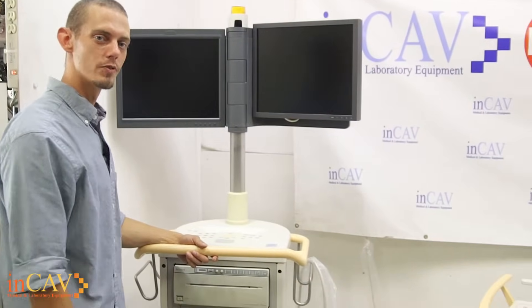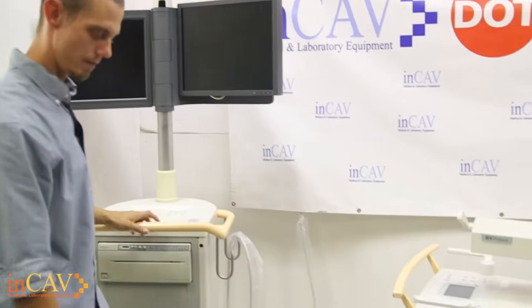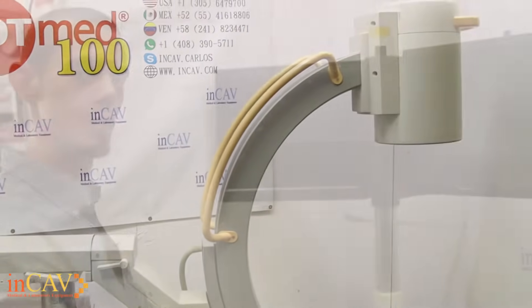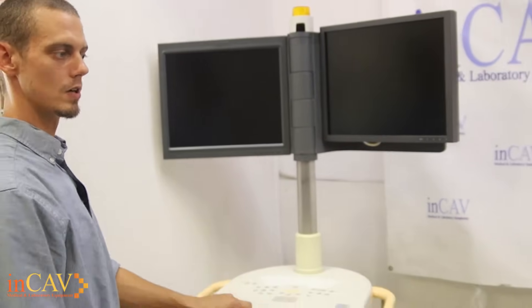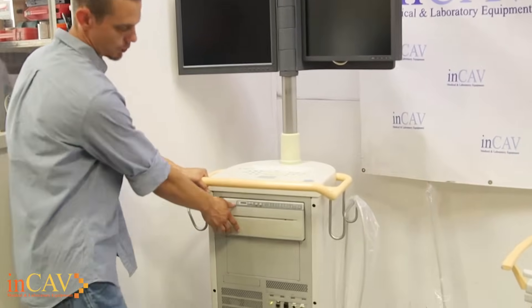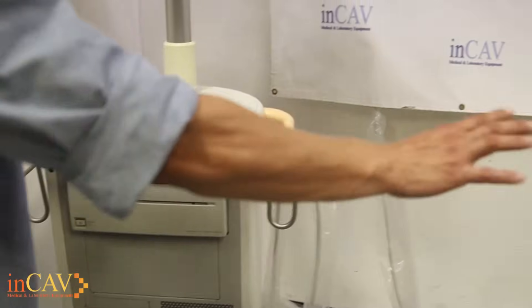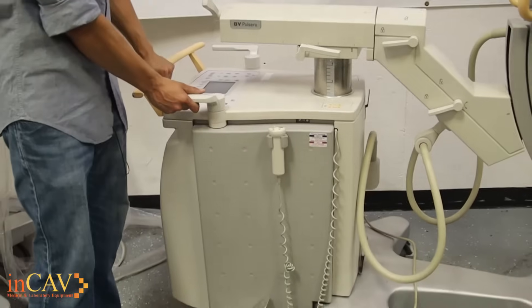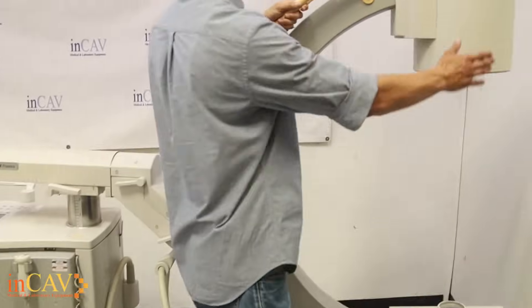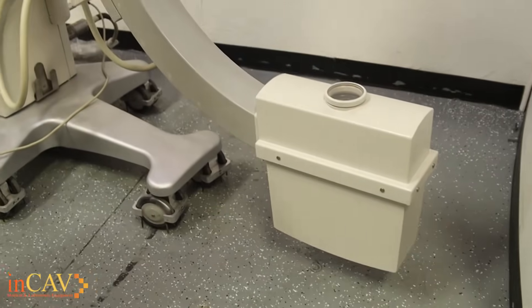What we have here is a Philips BV Pulsera second generation. We have LCD flat panel monitors, our foot panel, as well as our hand switch. The main components of the BV Pulsera is your workstation and your C-arm. The workstation comes equipped with the printer as well as your network connections, mouse, video and your USB port here. Over here we have the C-arm itself, or fluoroscopic machine. You have your foot panel, your hand control, and then of course your intensifier camera as well as the X-ray tube here. That's the primary units.